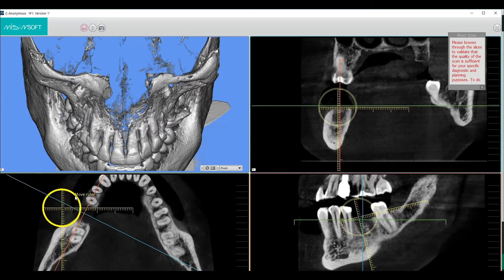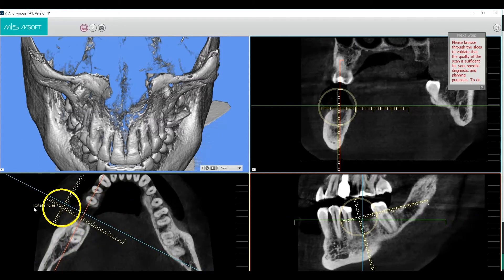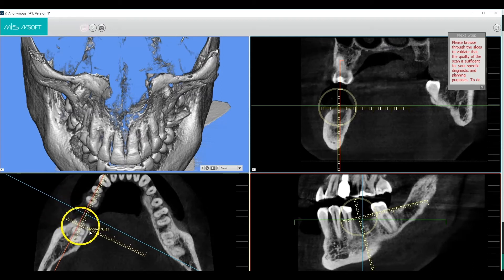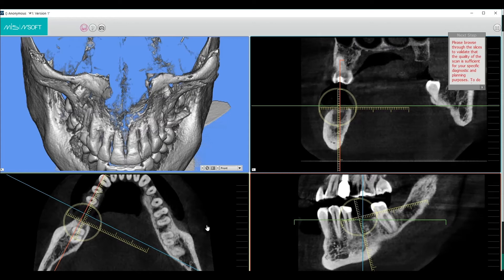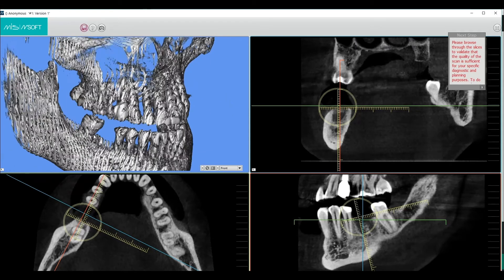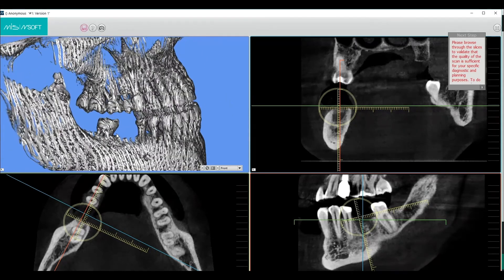The measure tool is found in all three 2D slice views. Touch the measuring wheel with the cursor to activate it — its color will change to bright yellow. While activated, drag the measure tool to the position of interest and measure.